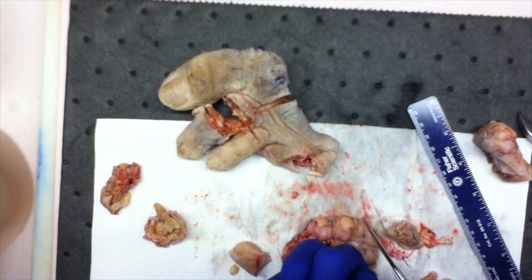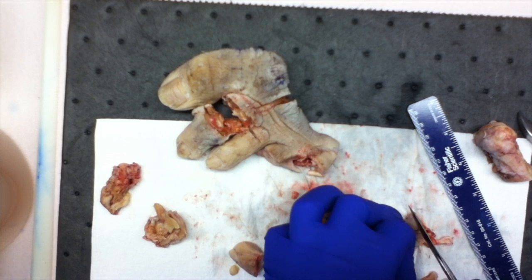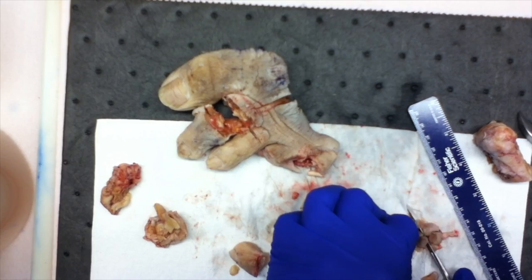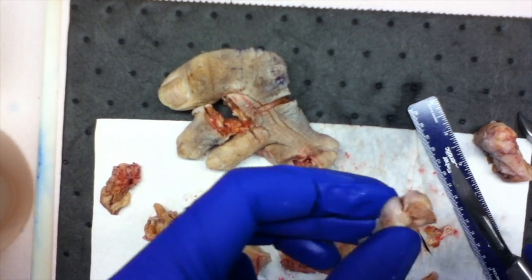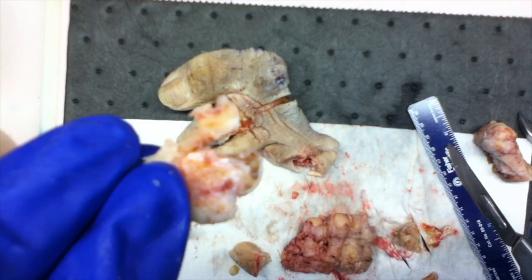I suspect they're right about this one though. See how easy I was able to cut through that piece of bone? So you can see that bone right there, soft.